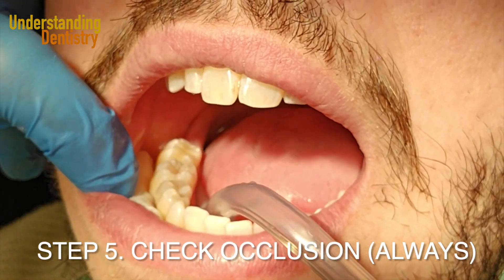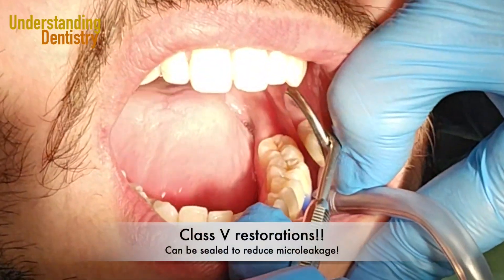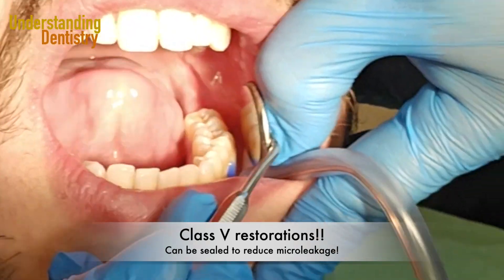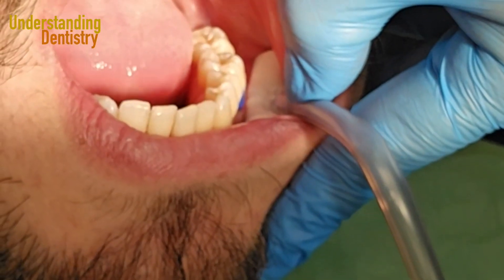Then we need to check the occlusion and that's it. For Class 5 restorations, this sealing reduces micro-leakage, and that's proven by the literature.